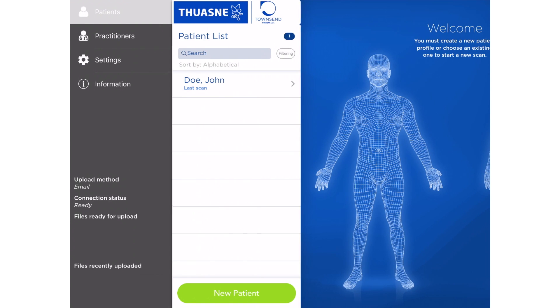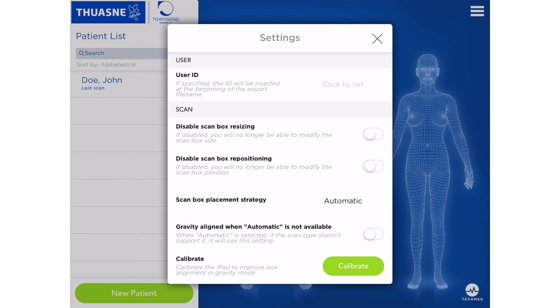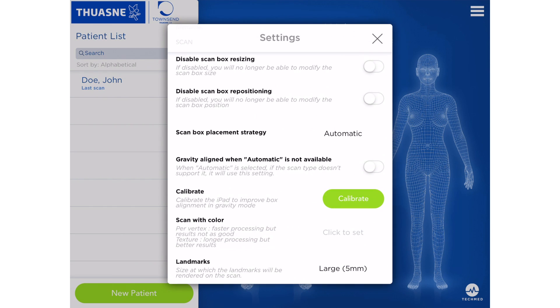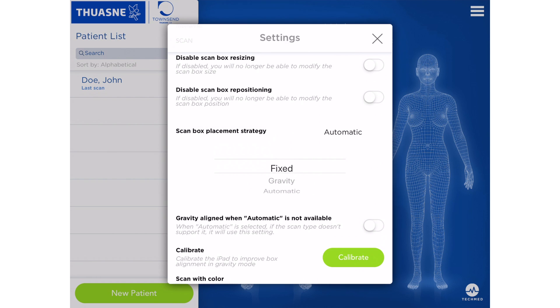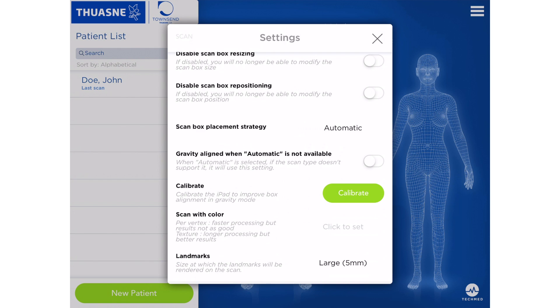Go into your settings in the TUAN 3D app and establish your ScanBox Placement Strategy and your email recipients. In your settings, you'll find an option titled ScanBox Placement Strategy. Once located, change the preferred selection to Automatic. This new option allows you to forget about sizing and positioning of the scanning border box.